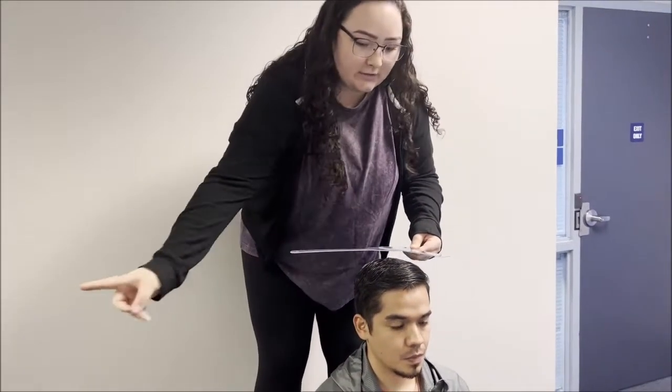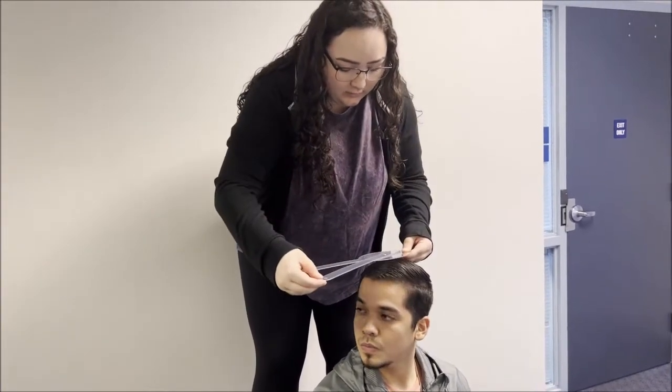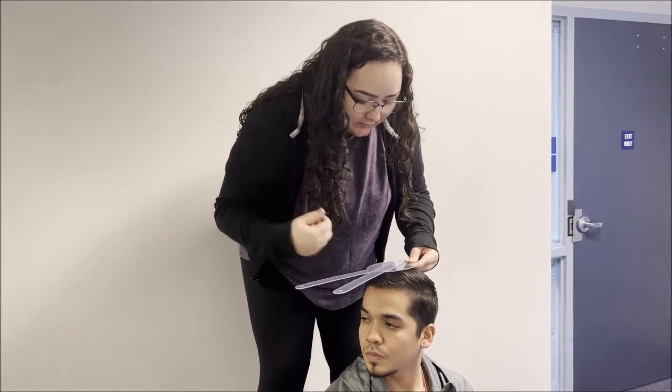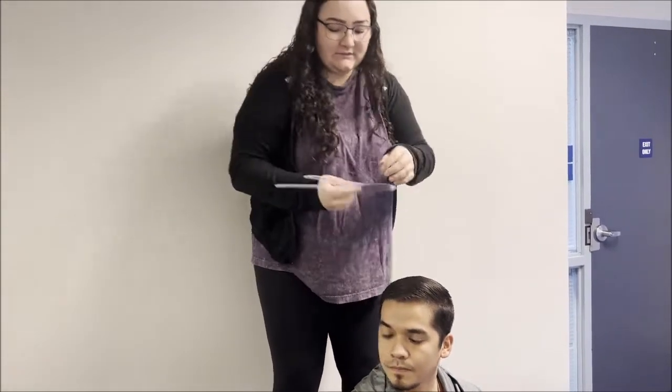All right, go ahead and look to your right for me. Oh, you're fine. Lining it up with the nose again. All right, it looks like he is about 68 degrees of range of motion there.